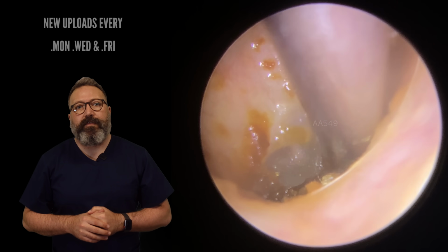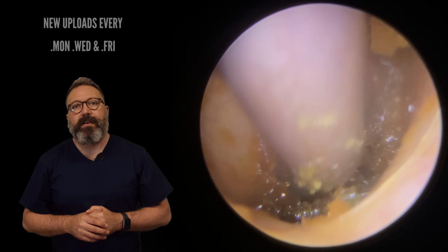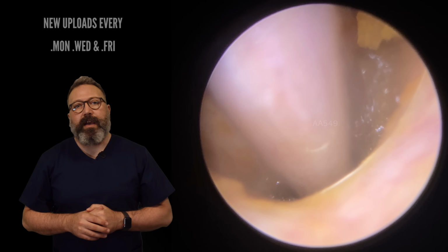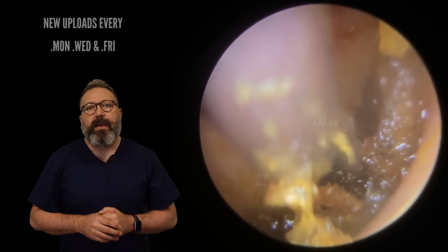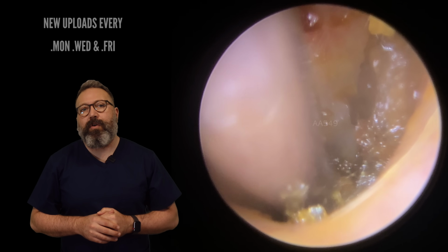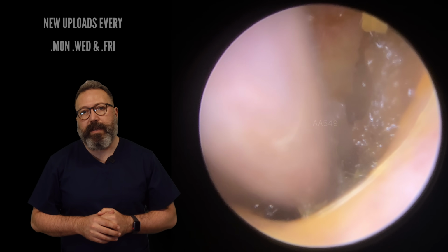Let's see if we can lift this out of the recess. What I'm hoping for here, I'm just gonna get a grip on the very leading edge of this wax to lift it up. What I'm hoping for here is that the whole thing will lift out of the recess in one piece.